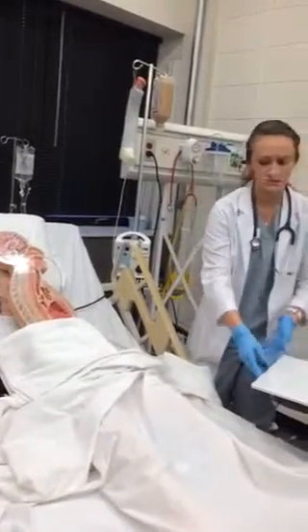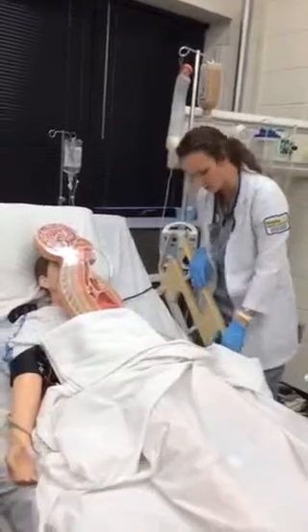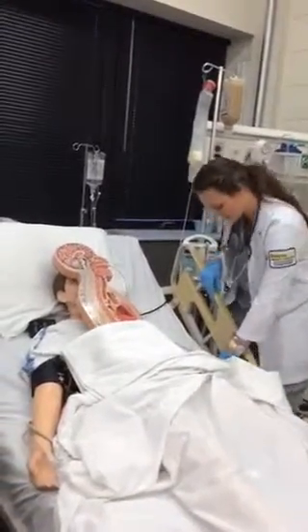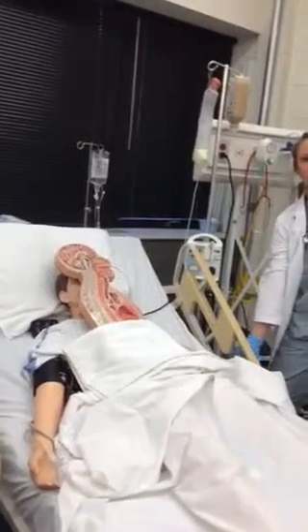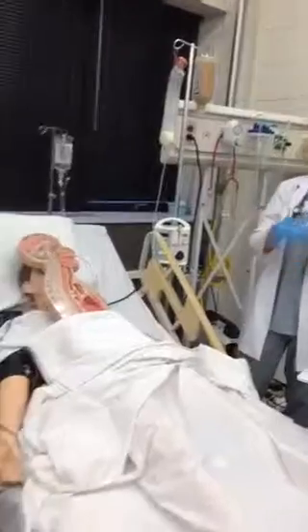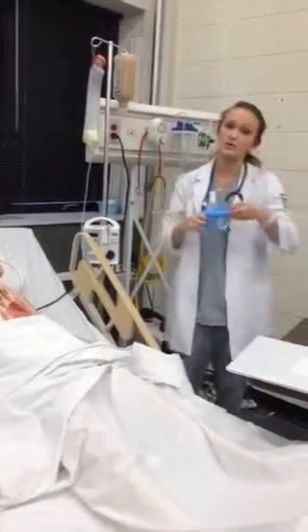And once you're done with that, you can put the patient back down to a safe position with their call light. And once they have the call light and they know how to use it, you can take off your gloves, wash your hands, and you can report and record your findings.